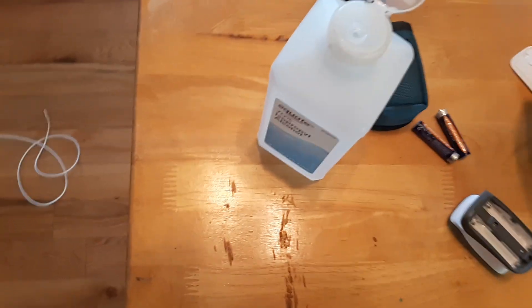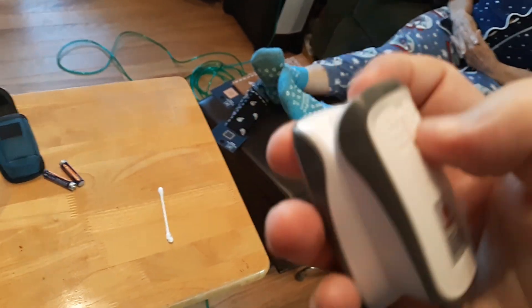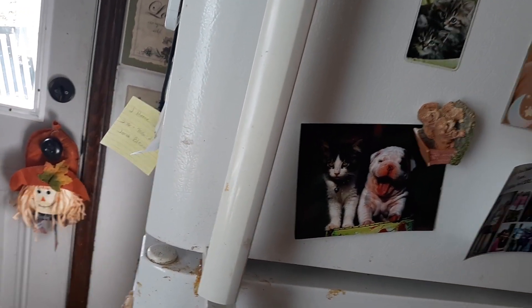Now I want to show you what's called the nuclear method, because what else do you have to lose if it's broken, right? Take it — without the batteries inside — to your refrigerator. I know this might seem like a joke but it does work if you've tried everything else. Keep it inside the freezer where it's freezing cold and leave it in there for a good six to seven hours.